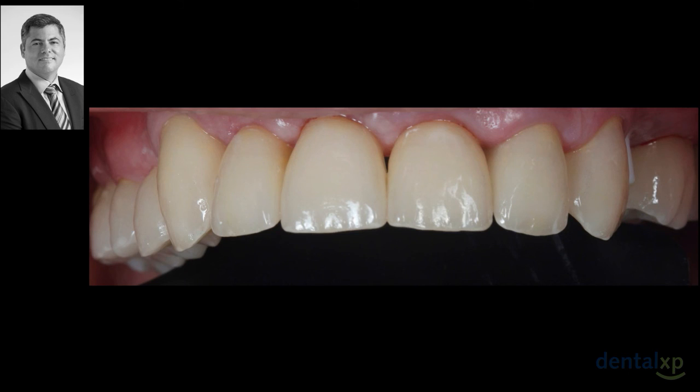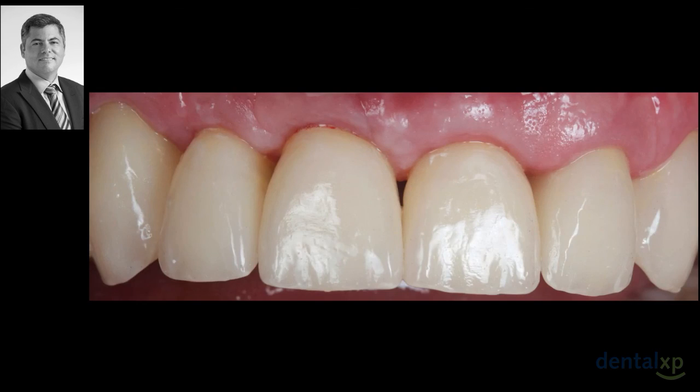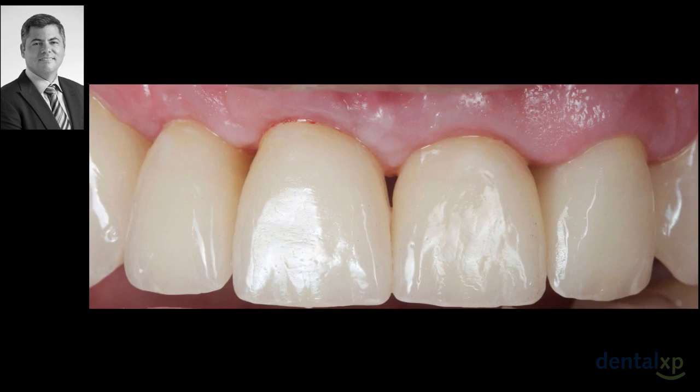This is the first try-in. The technician had to do some modifications in relationship to the interdental contacts, and he had to get some of the interproximal contacts remodeled so food wouldn't get packed in between. This is a close-up shot during the cementation process, right after cementation. And again, the translucency and the colors are beautiful. Look at the gingival stippling over here.